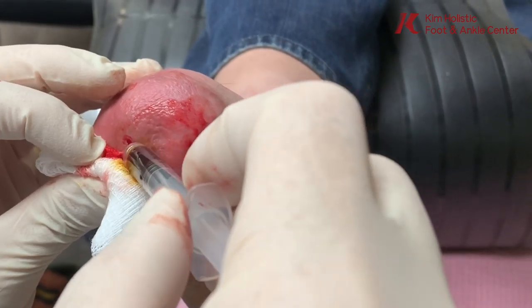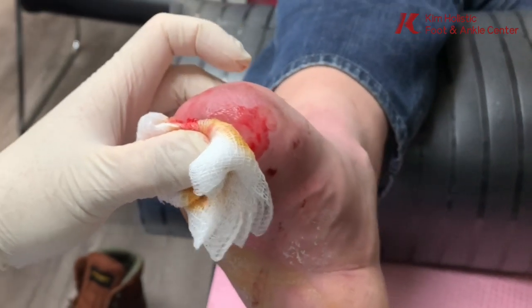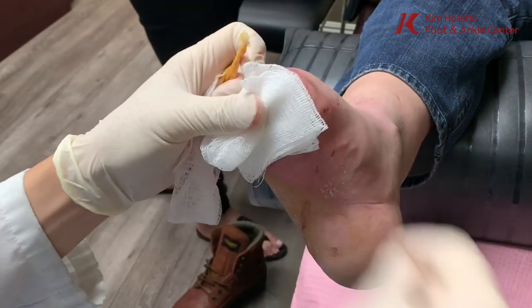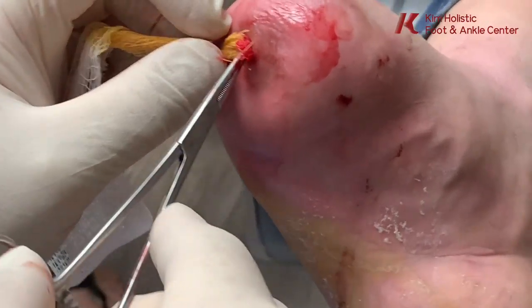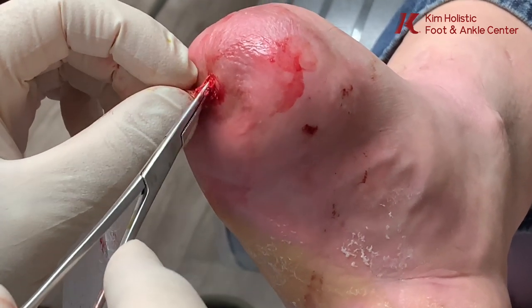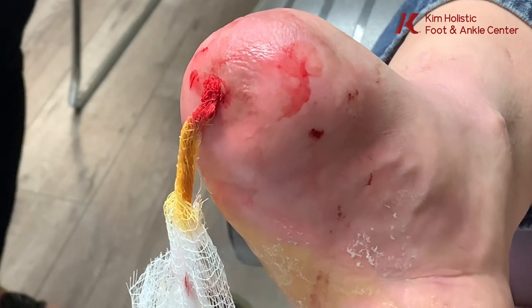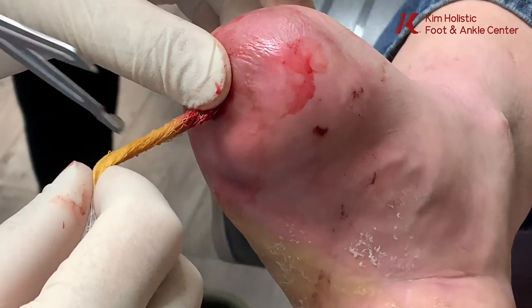We'll just pack it — we'll use the tip of the 3x3 gauze. We're gonna pack it so he doesn't close over, so when he soaks it the stuff can come out — whatever is still there. Just cut this right here so he can't pull on it to take it out.